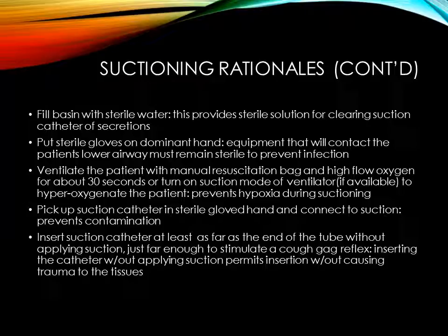Ventilate the patient with manual resuscitation bag and high flow oxygen for about 30 seconds, or turn on the suction mode of the ventilator to hyperoxygenate the patient. This prevents hypoxia during suctioning. Pick up suction catheter in sterile gloved hand and connect to the suction. This prevents contamination.